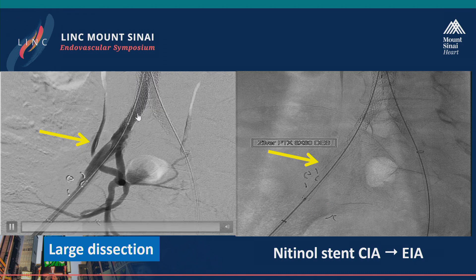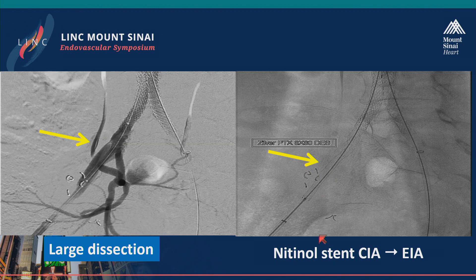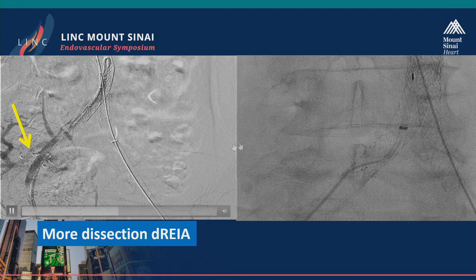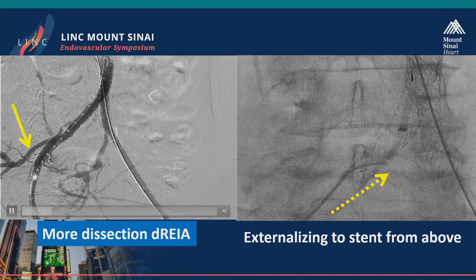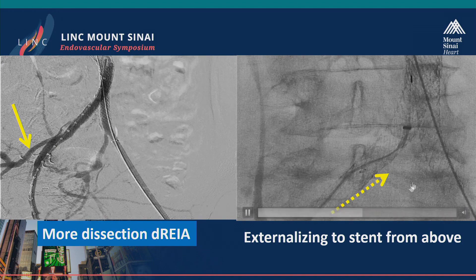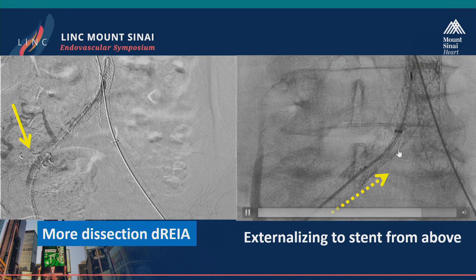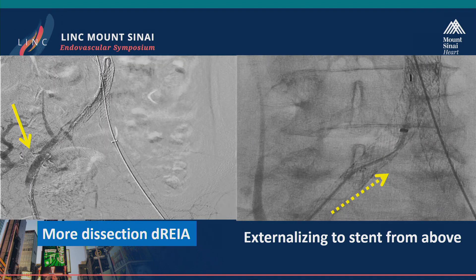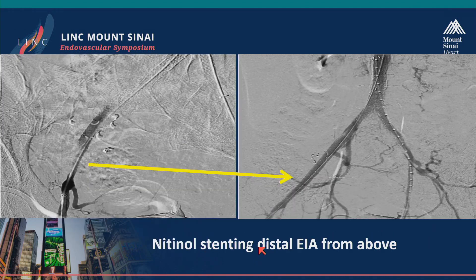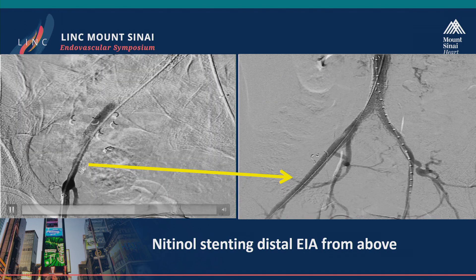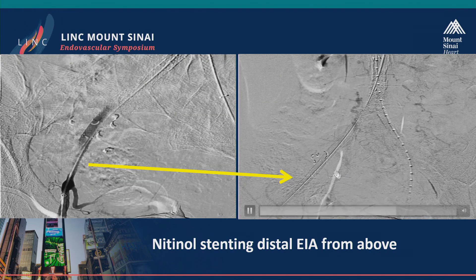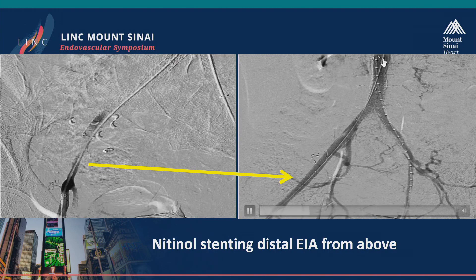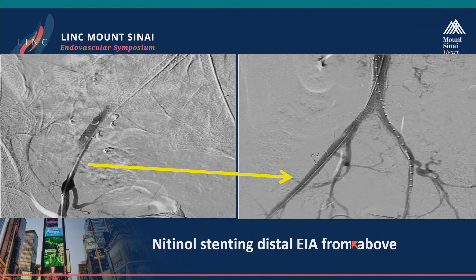Going back and forth on stent choice — we've got a nice result in the common, but you can see the dissection extending from the common into the external iliac. That's a great place to use a nitinol stent. Now there's a little bit more of a problem here, so like has been shown, we snared a wire into a 4-French catheter so that we can do this last stent from above so we don't get too close to the common femoral artery. And here we stent that from above using that externalized wire — a nice result in all with a combination of nitinol and balloon expandable stents.